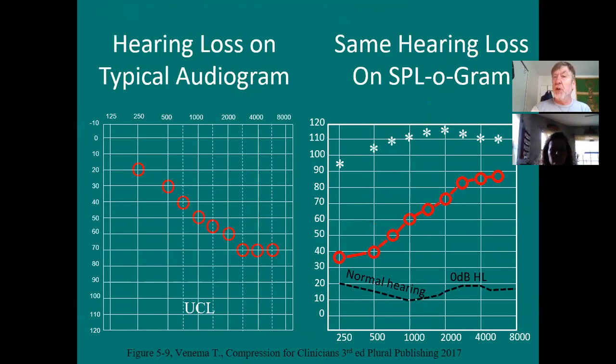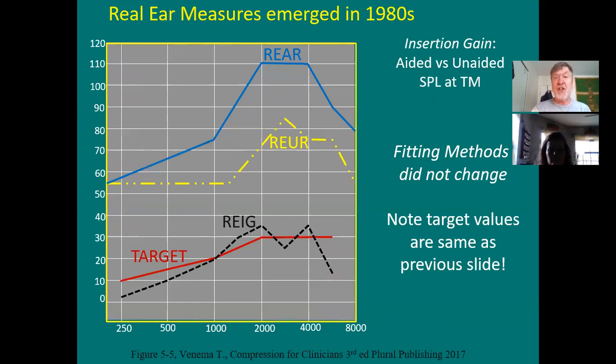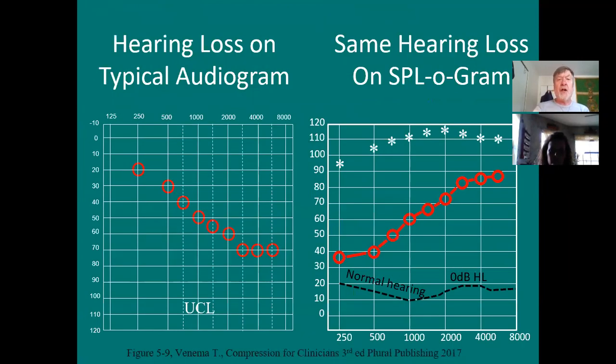So it was a terrible tool, however, for counseling, because it just does not describe the benefits of the hearing aid. And it doesn't really teach clients why they would want to amplify. And Seewald didn't like that. That always bugged him. So he looked at an audiogram like this on the left, and he said, oh, that's just great, but let's make hearing loss and hearing aids speak the same language. Let's change the hearing loss in dB HL into hearing loss in dB SPL. And let's make the numbers go up.